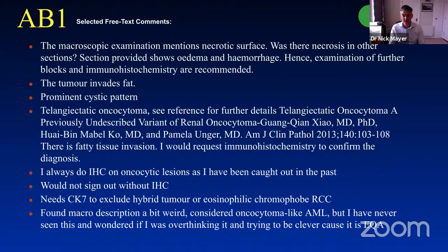Then a comment down here that somebody was considering something a bit more weird and wonderful because it's an EQA case, but that just gives me the opportunity to say we're not trying to catch people out with cases here. We put in what we get, so to speak. If you are submitting a case, please put in all the info that you had when you actually made the diagnosis, so morphology and immuno. So how did we do?